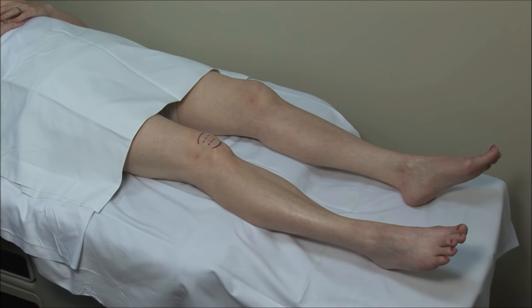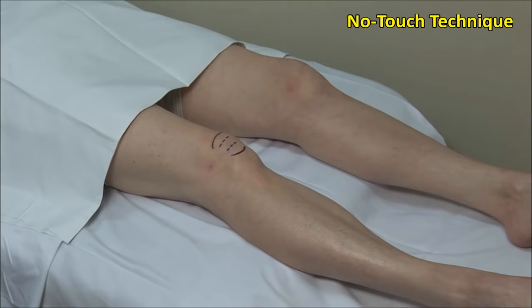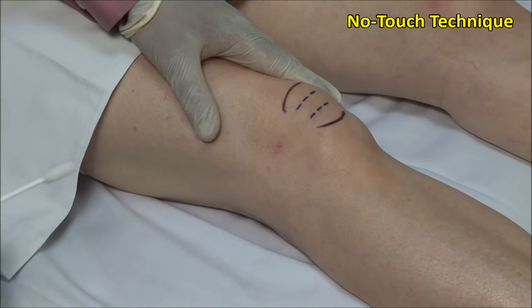Lateral retropatella injections are done with the patient lying supine and the knee extended. These injections should always be done using sterile precautions. A no-touch technique is used, meaning that once the area is cleaned, it must not be touched with anything but sterile needles.